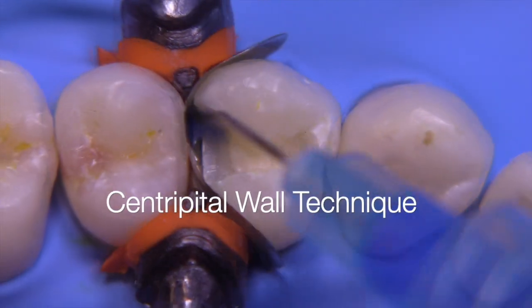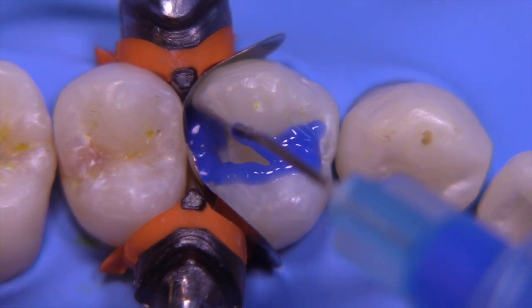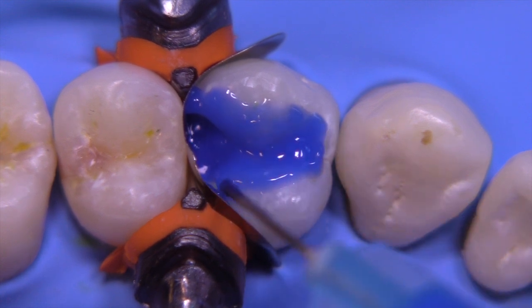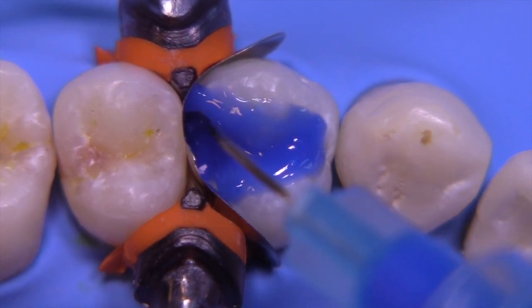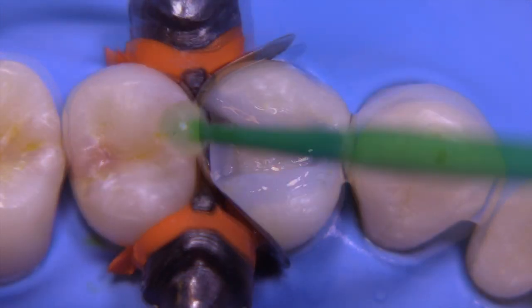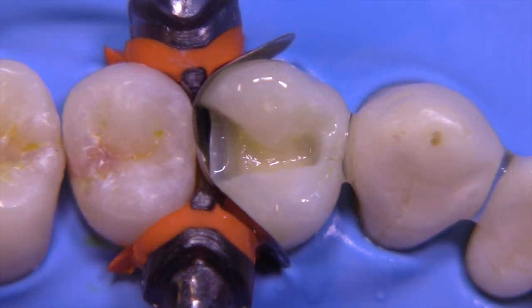We're going to go ahead and apply our conditioner or acid etch, etching beyond the margins at least a millimeter and a half to two millimeters. Then we're going to rinse and suction so that it stays moist.